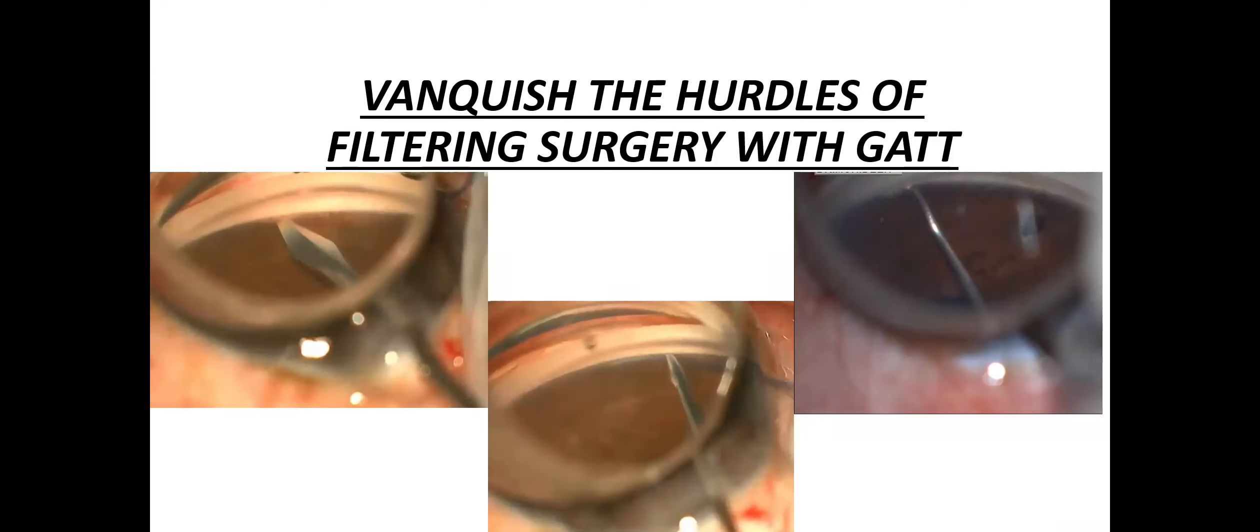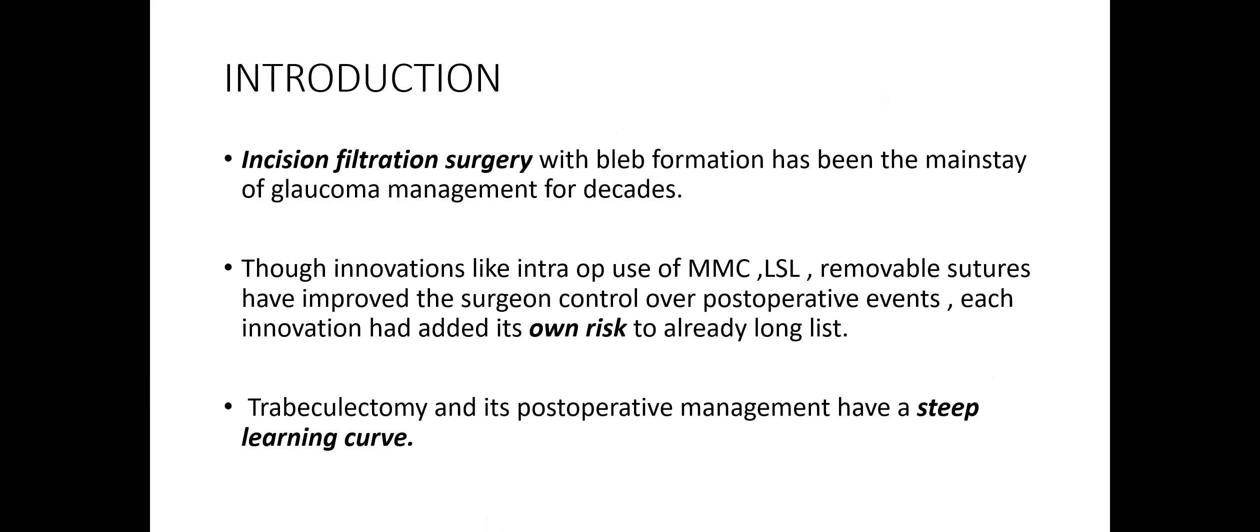Vanquish the hurdles of filtering surgery with gonioscopy-assisted transluminal trabeculotomy. Glaucoma is the leading cause of irreversible blindness worldwide. Trabeculectomy has been the mainstay of glaucoma management for decades.